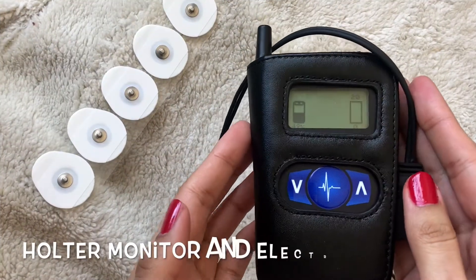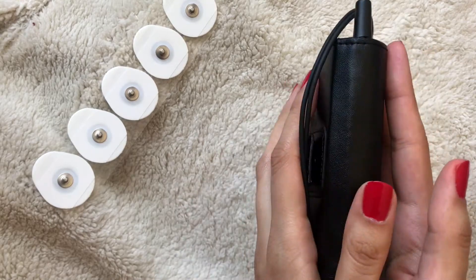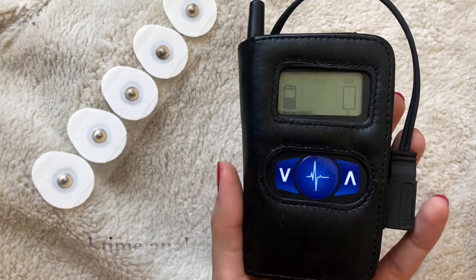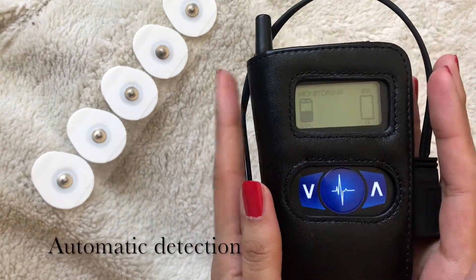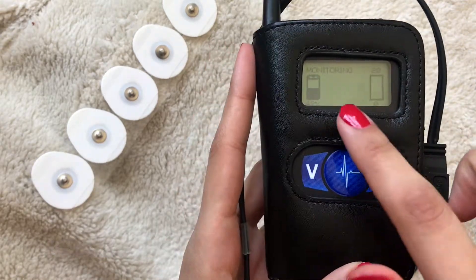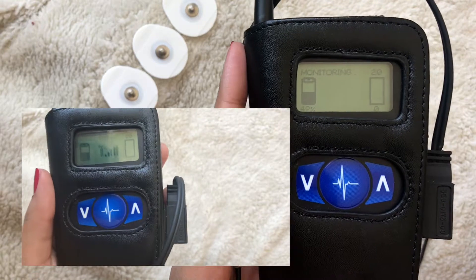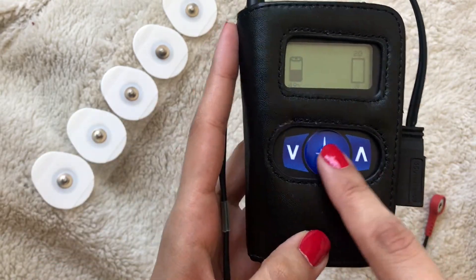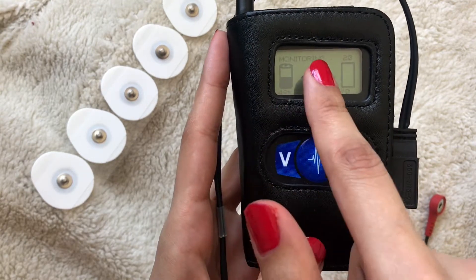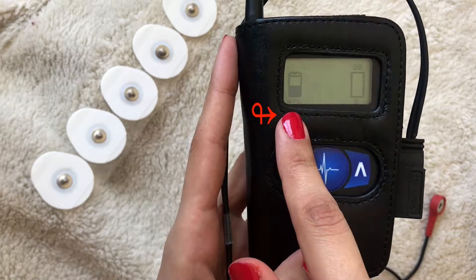This is the Holter monitor — it is through CardioNet. As you can see it's fairly large in size. It has a clip on the back to attach to the side of pants or jeans. The CardioNet monitor is great because it has real-time analysis of your heart and heart rhythm. It automatically detects any abnormalities or pauses in your heart rate and wirelessly transmits the information through cellular data. It has a symbol that shows when it's transmitting and whether there is cellular signal. There's a large central button and two arrows on the side to navigate the menu. It's currently monitoring, and it indicates 49% battery life remaining.